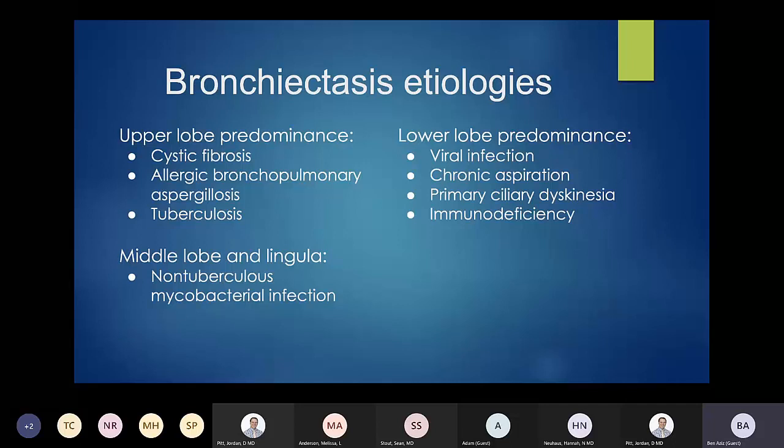On this coronal CT maximal intensity projection image, you can really see the pulmonary vessels and bronchi. There are bilateral dilated bronchi with mucoid impactions and tree-in-bud opacities. Where this curved arrow points, there is a bronchus showing a varicose or cystic type dilation that should be open but is completely impacted with mucus. Down here, there's a pretty enlarged bronchus about 1.5 centimeters from the pleural surface — there's no way that bronchus is going to taper within that one centimeter, so you can use that as a clue that you're looking at bronchiectasis.